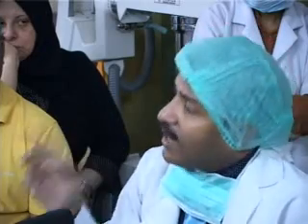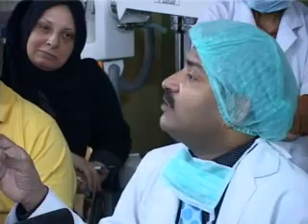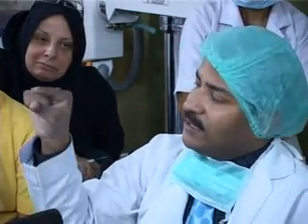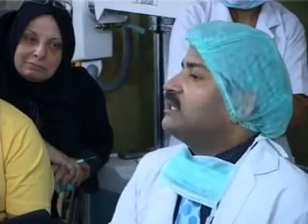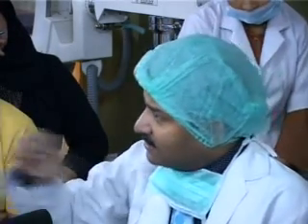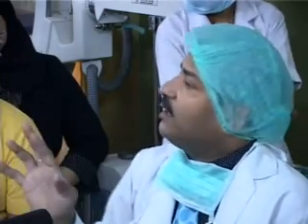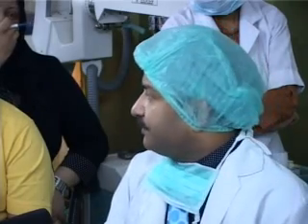It might be why this habit came, that long ago we were using thermal cautery, and in thermal cautery there was heat which was destroying the tissue. But these are high frequency radio frequency wave currents, and they don't produce much heat. The changes in the tissue are due to the turbulence of ions inside the cell, vibration of the ions inside the cell, and the mechanism is completely different. So heat produced is very less in this type of cautery machine.